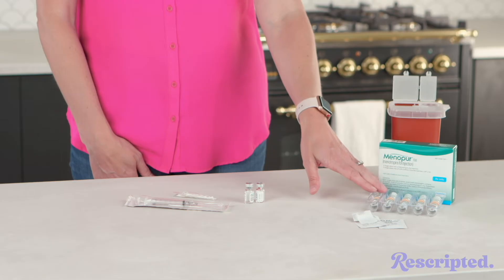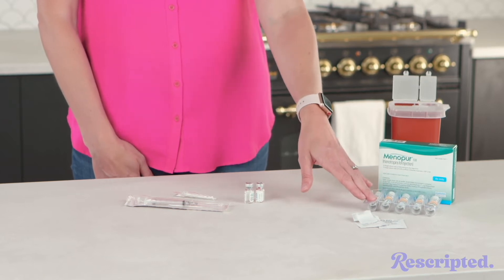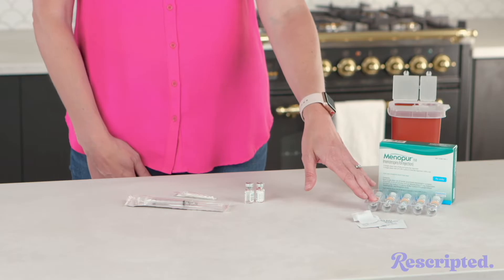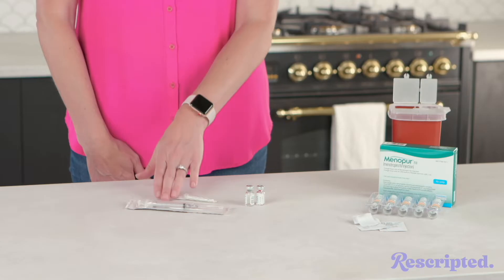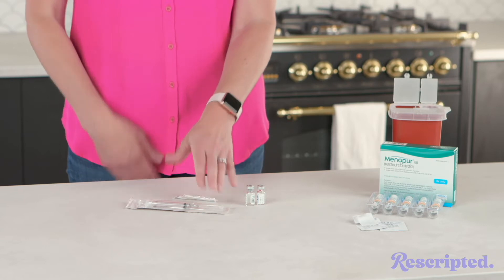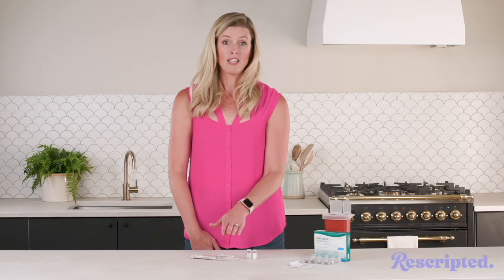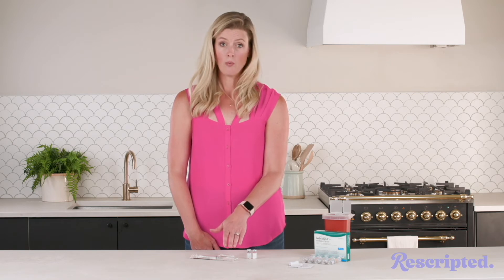Each box comes with five vials of the medication as well as a corresponding vial of sodium chloride. You're going to get your syringe, typically three milliliters, and a mixing needle. Sometimes it comes attached, sometimes they come separate. That mixing needle is typically 22 gauge, one and a half inch.